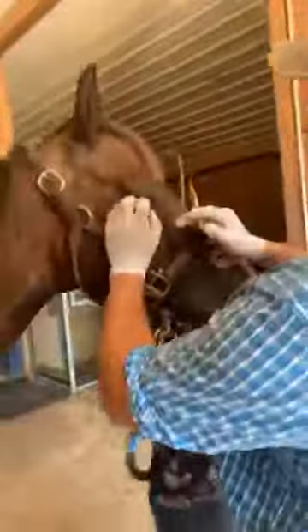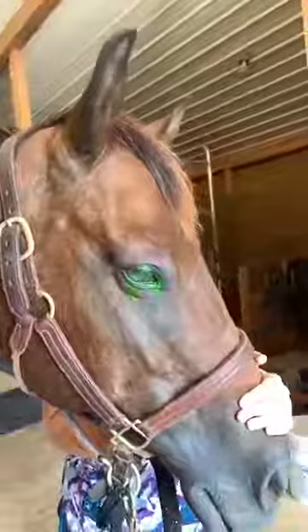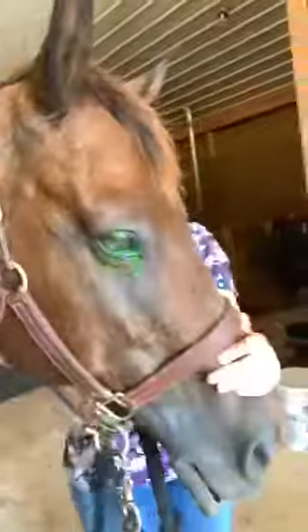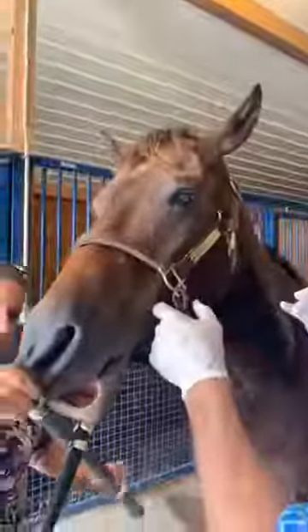So, this is Guinness. We'll just stain his eye first. The stain we use is a fluorescein stain. Any disruption in the outer layer of the eye will cause stain uptake, and you'll see it as more of a green appearance. I'm going to do the other eye because he does have this problem in both eyes. A little extra help for keeping him quiet.